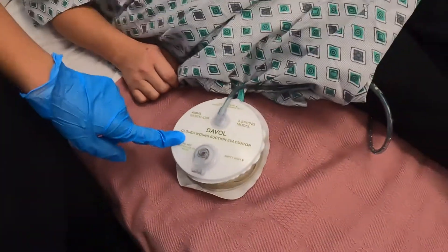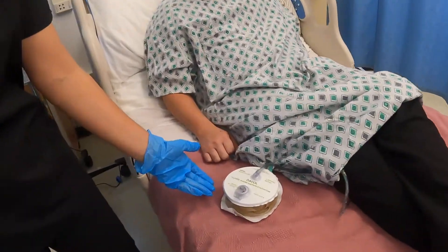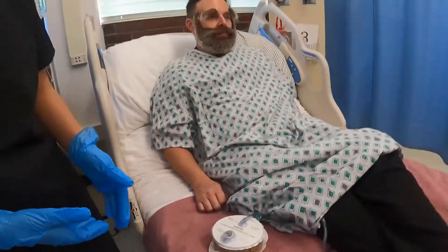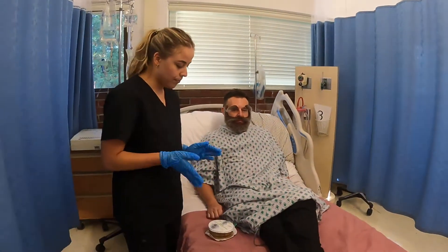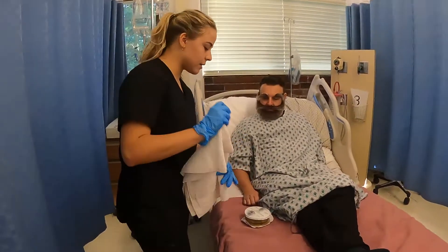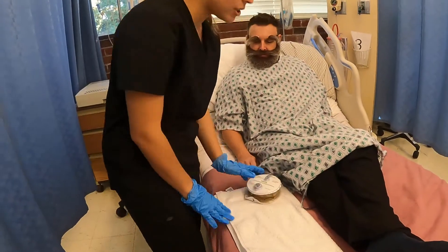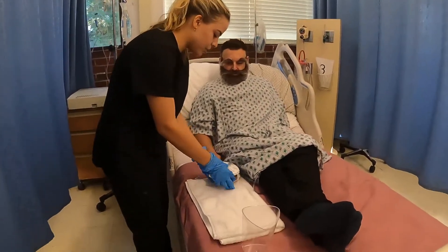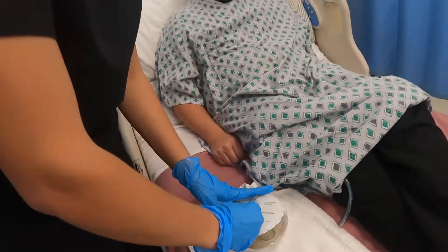This also works by suction, and as you can see it's fully expanded, so it's not really functioning the way it should be — we need to completely drain it. I have my towel ready just to protect Hector's sheets. I'm going to put that under here, and I have my collection cup ready.